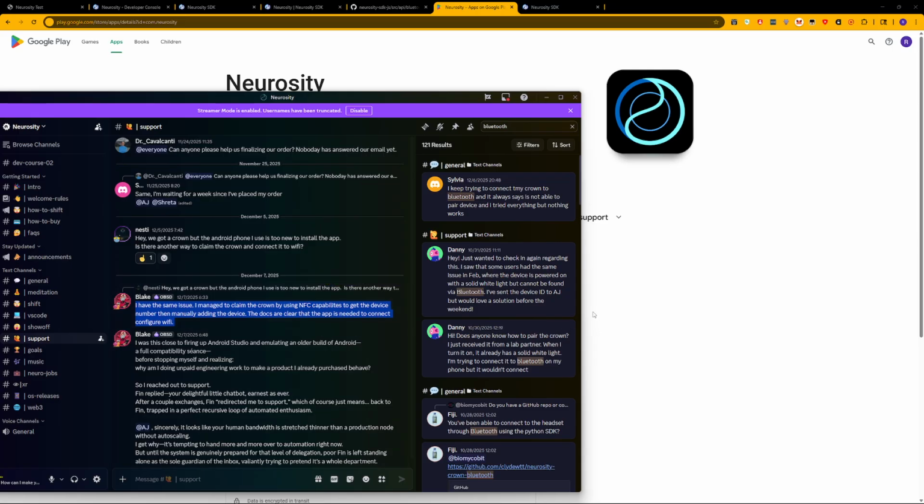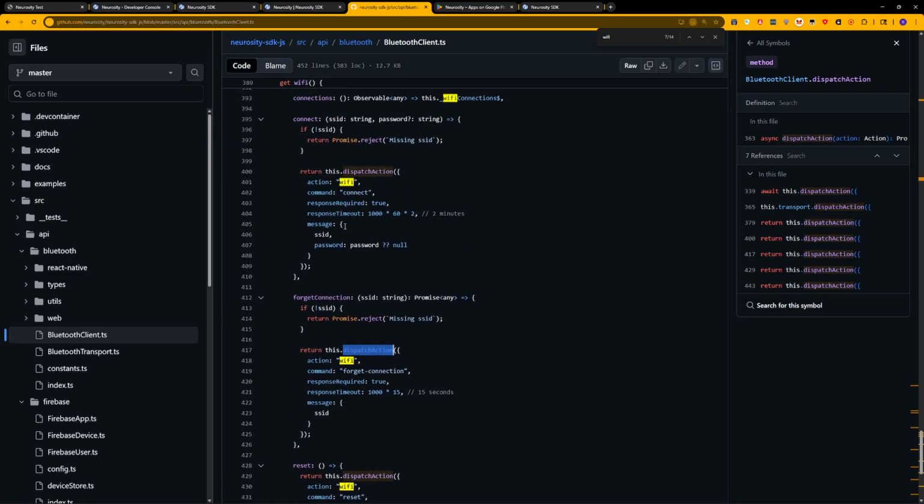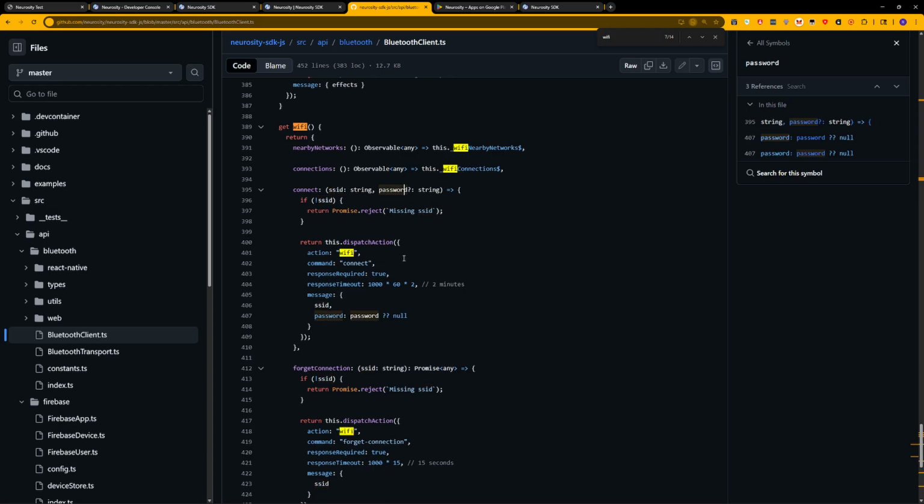So what did I do? I was looking through the SDK, and the SDK has this Bluetooth client, which is the Bluetooth communication that you can do with the device. And I found out that there is a dispatch action, which is a Bluetooth action. I don't know anything about it. It's sort of extracted into more class hierarchies, etc. But the point is, hey, we can dispatch an action that will connect it to an SSID with this password. And I'm like, you know what? I can do that. And I have.